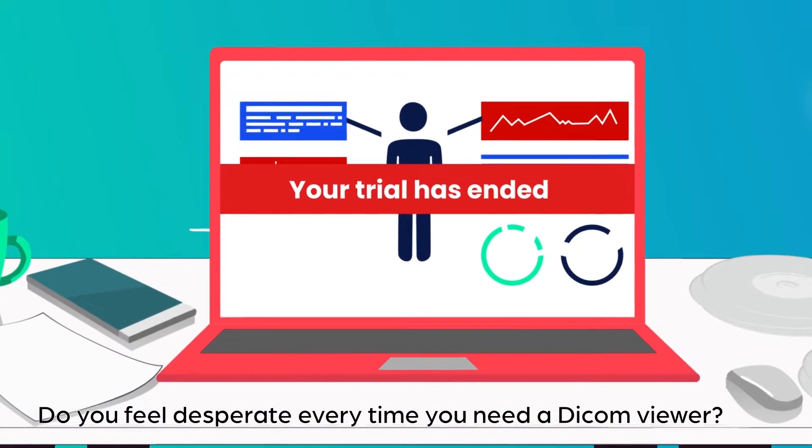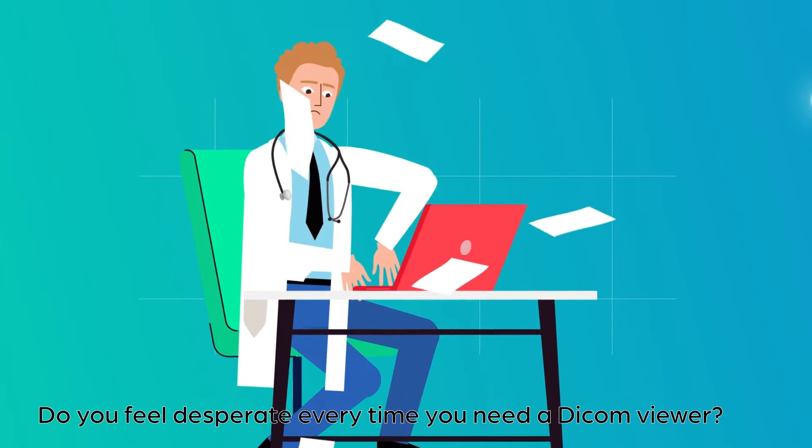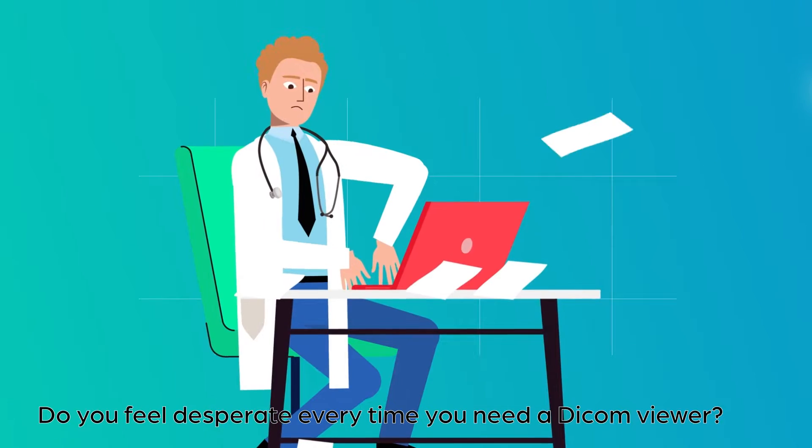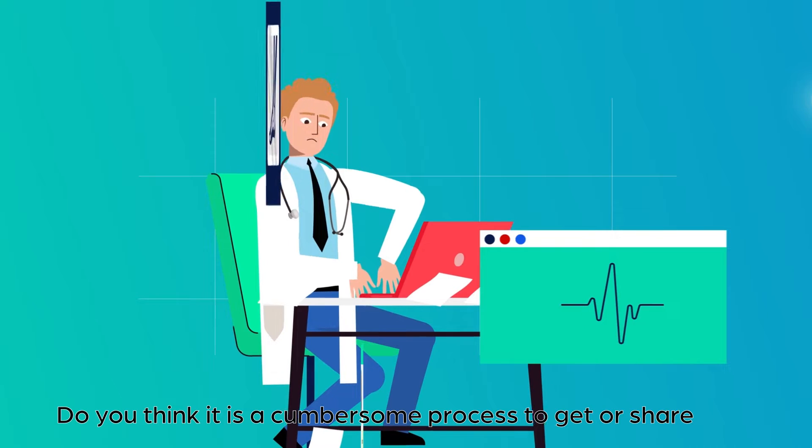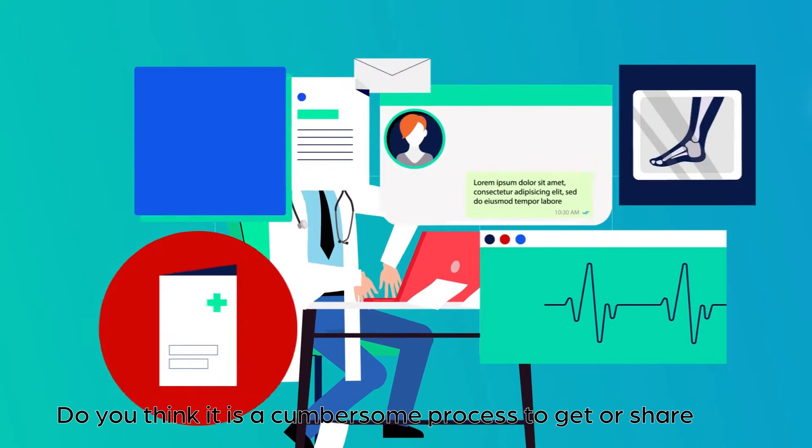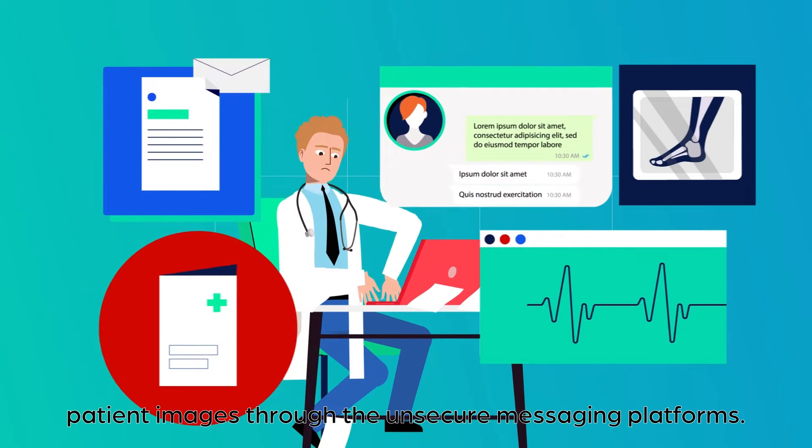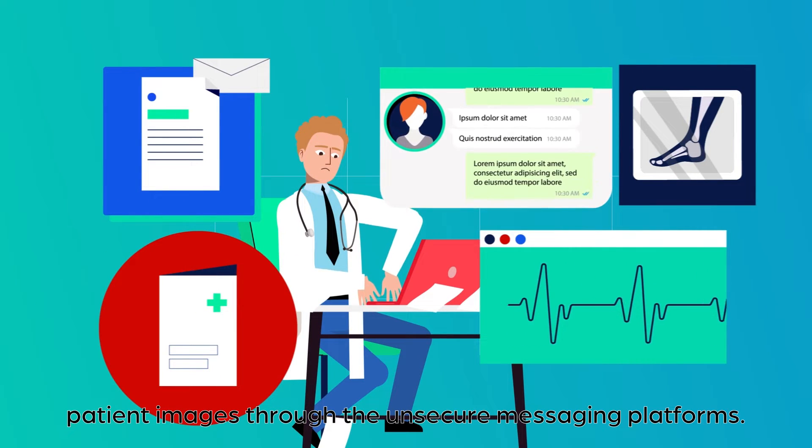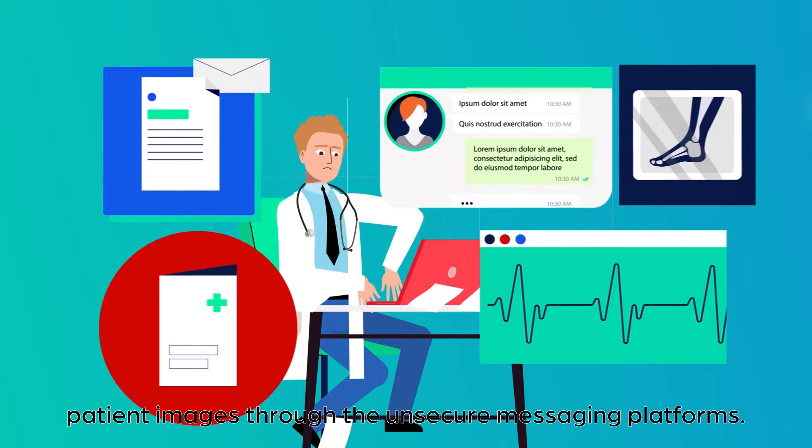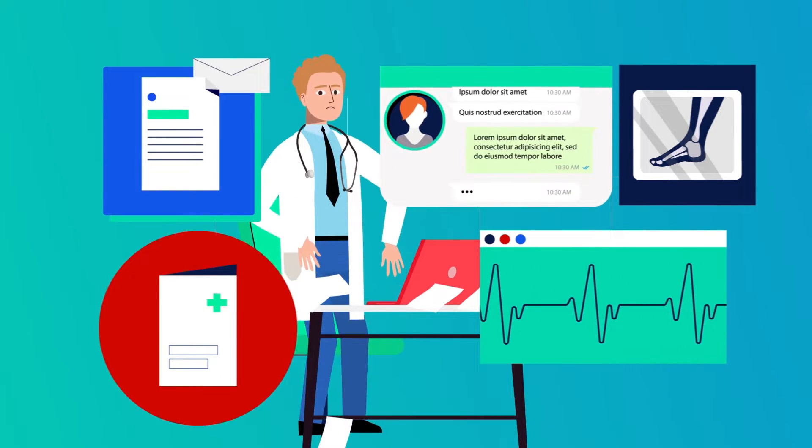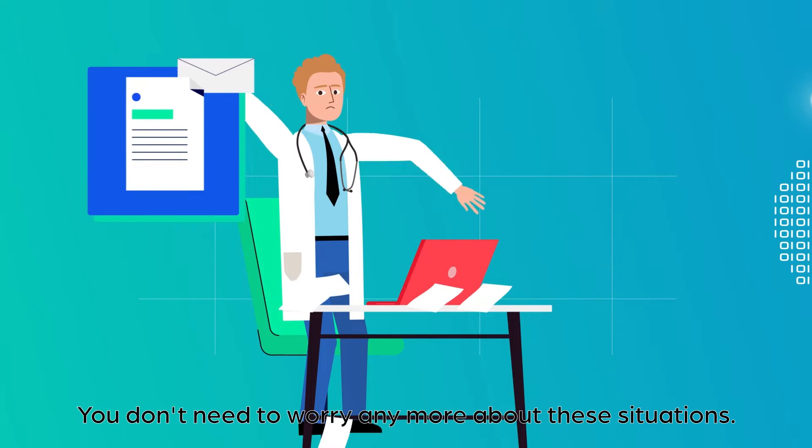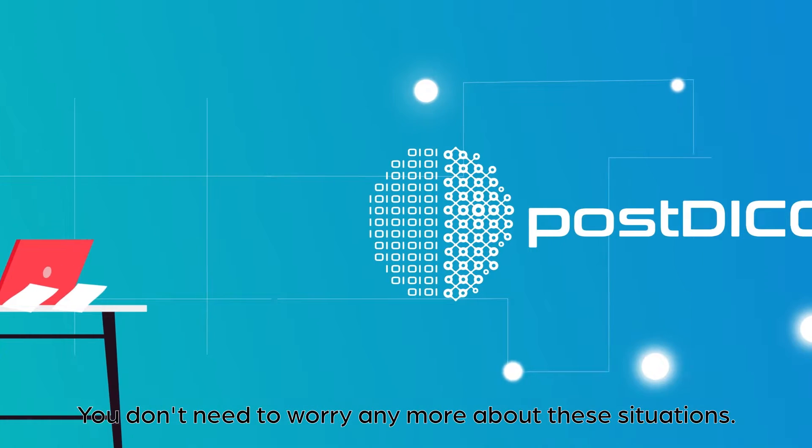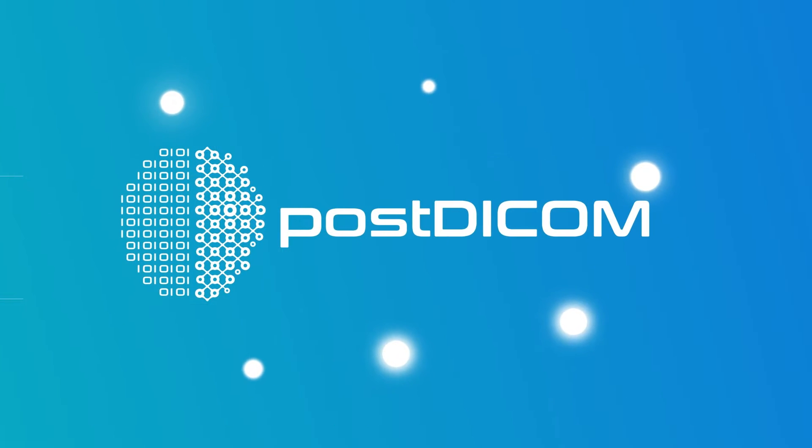Do you feel desperate every time you need a DICOM viewer? Do you think it's a cumbersome process to get or share patient images through unsecure messaging platforms? You don't need to worry anymore about these situations.